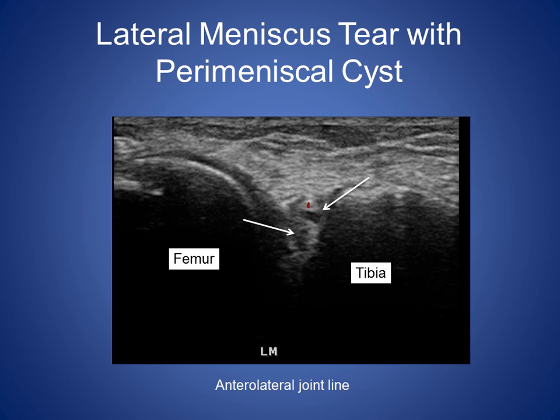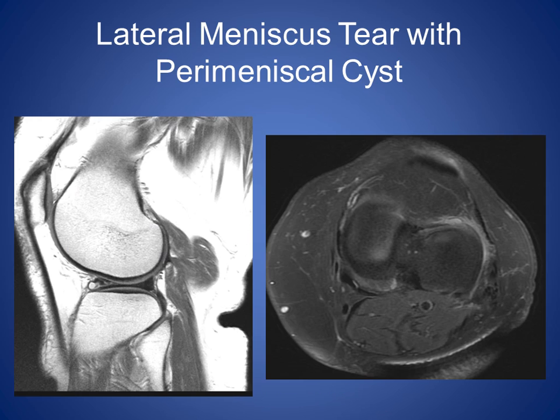Again, you're probably not going to be asked to look for meniscal tears, but sometimes patients have knee pain and you're taking a peek and you may see these things. Here is what it looked like on the MRI.